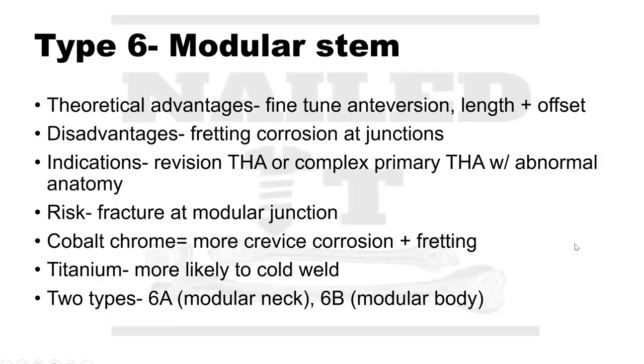Sounds great. And you quickly mentioned this a little bit earlier, but can we talk about the modular stem, and in what cases, in your experience, are you going to use a modular stem? I guess we touched on what it was a little bit earlier, but again, when are you going to use this modular stem? So first of all, with modularity, it's like, is that Spider-Man?